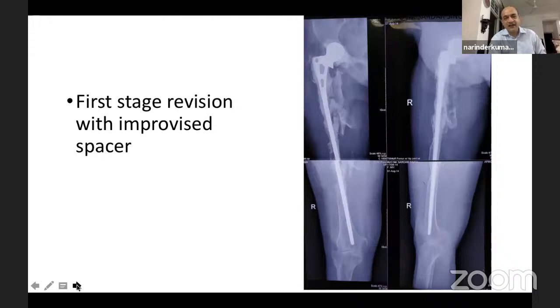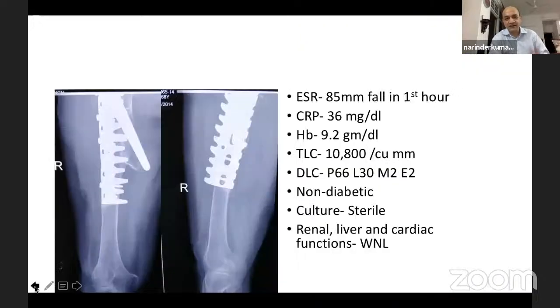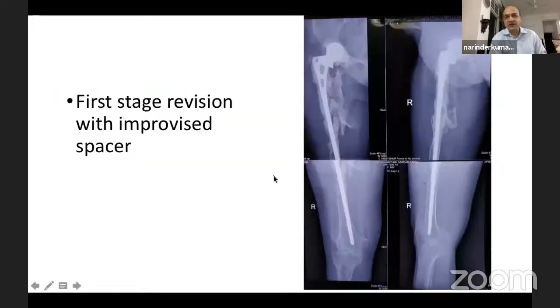So when I went in, I found there was hardly any bone left there under that plate. If you see this, the x-ray, here you pray and hope that there may be some bone there, but unfortunately, there was none. This is a customized spacer, which I was talking about, which we do.